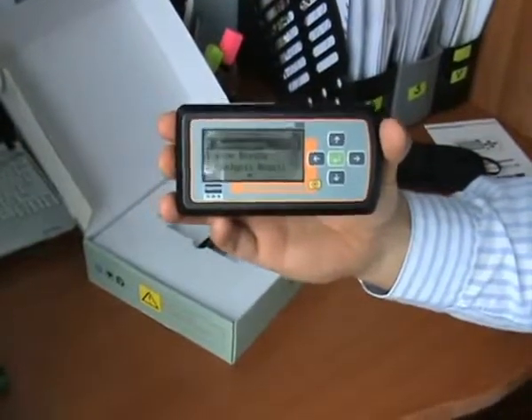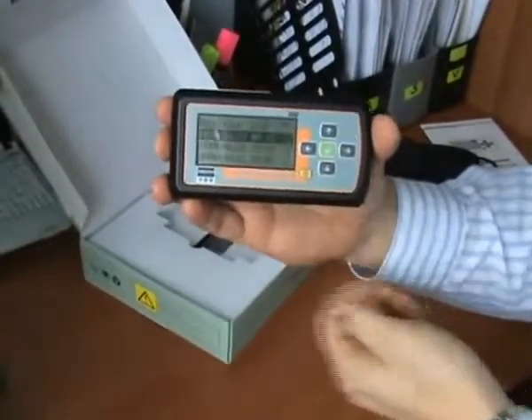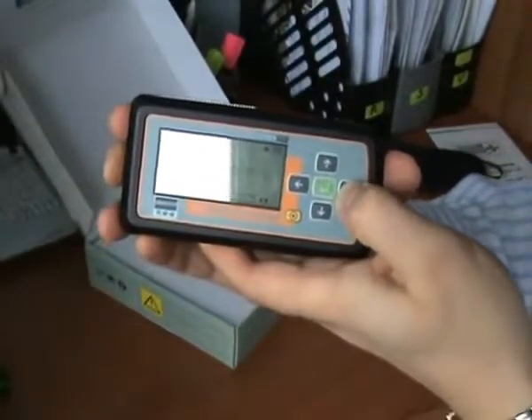Everything with me is OK. After that, someone can view again this waveform ECG record.